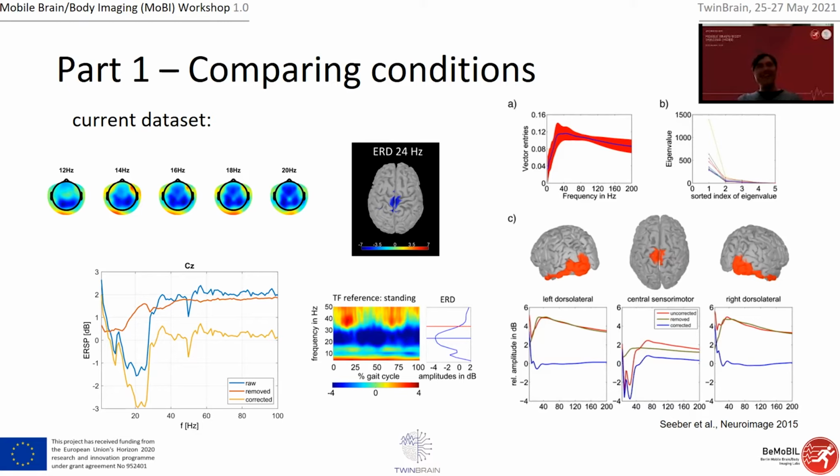I think this is really an overlay. When you just look at 12 hertz, it's only on posterior areas, maybe left, maybe right. And then there's a third patch somehow coming in. I think this is just the overlay of different sources with different frequencies. I don't have a functional interpretation for now.